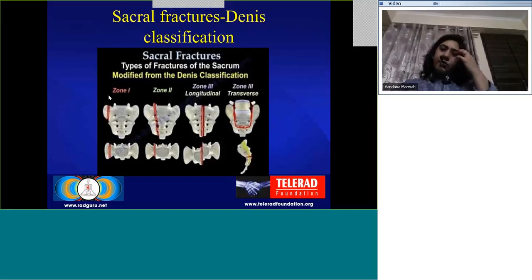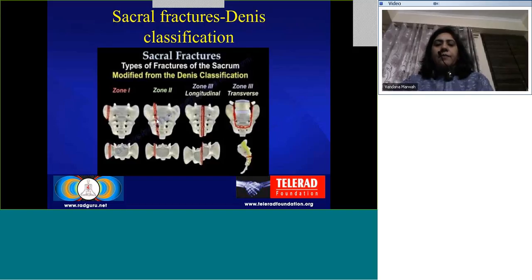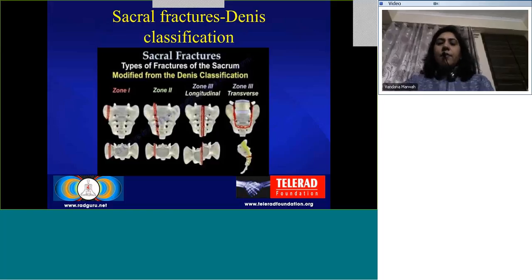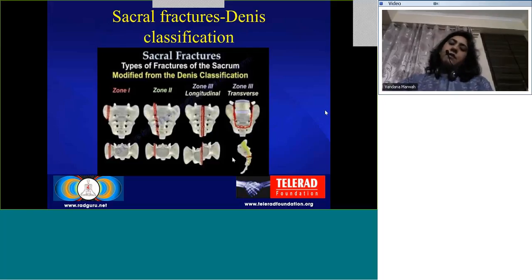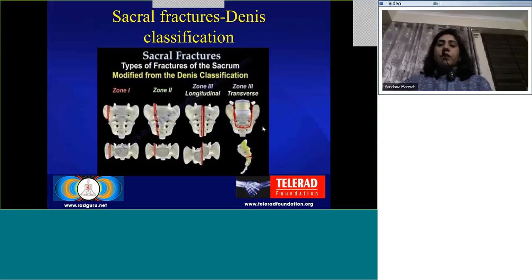A few words about sacral fractures. The sacrum is divided into three zones. Zone 1 fractures are through the sacral ala. Zone 2 fractures are through the neural foramina and are associated with neural injuries. Zone 3 fractures are through the central part, with narrowing of the sacral spinal canal, and are associated with compression of the cauda equina. Transverse fractures are also seen through zone 3 and are sometimes only picked up on lateral scanograms or sagittal reconstructions, as the transverse fracture may be totally missed on axial images.